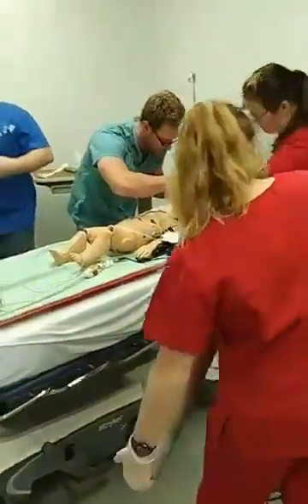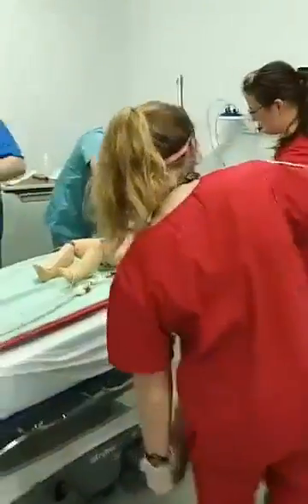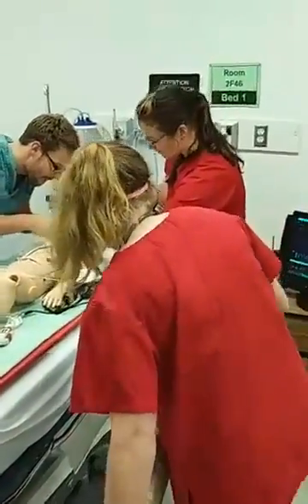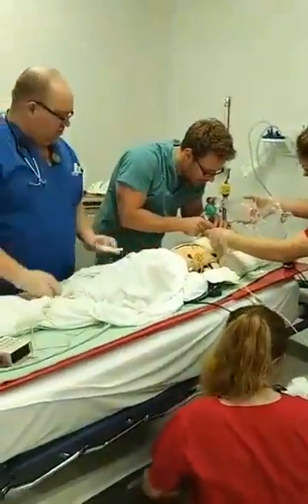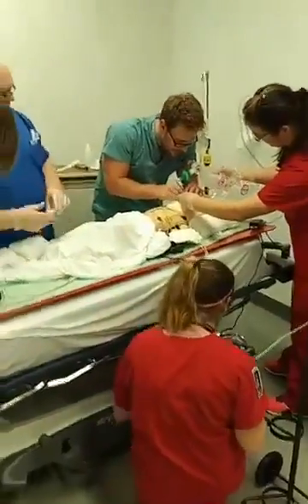Do we have enough oxygen? Yeah, we're putting that down as an option too, because we're going in an elevator. Last thing I want to do is get stuck and not have enough oxygen. Okay. And oxygen's on flush right now. Yep, you can throw that in there. Yep. The other way. Okay.